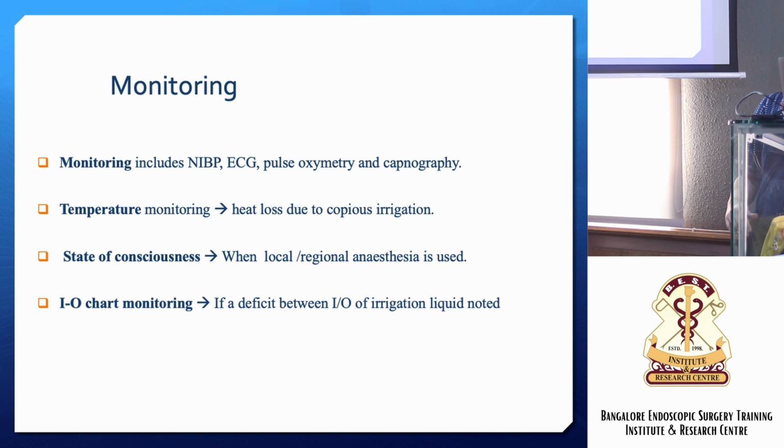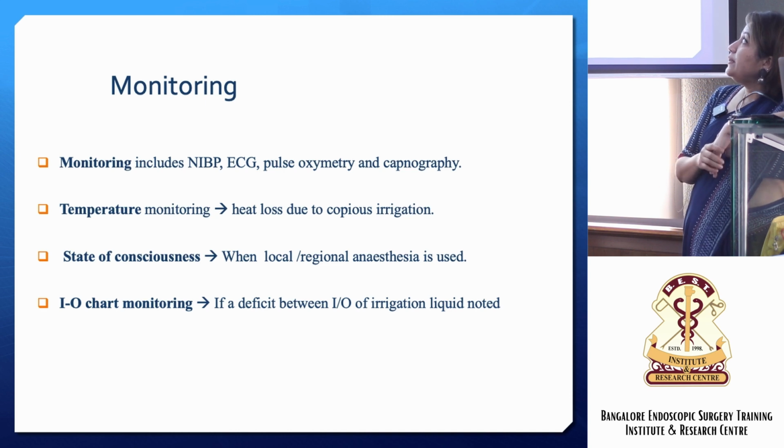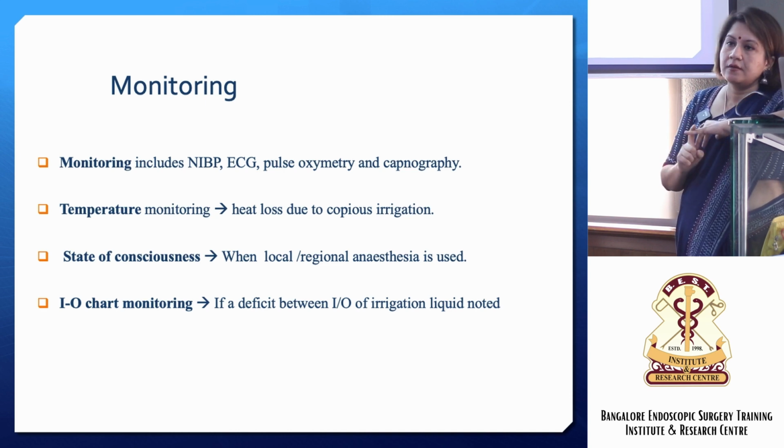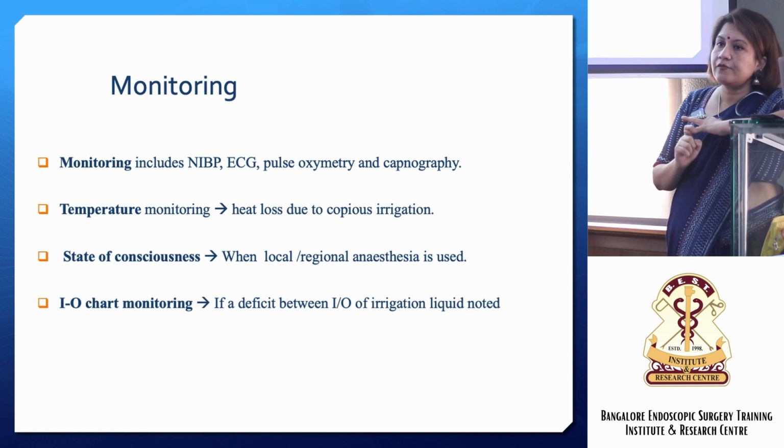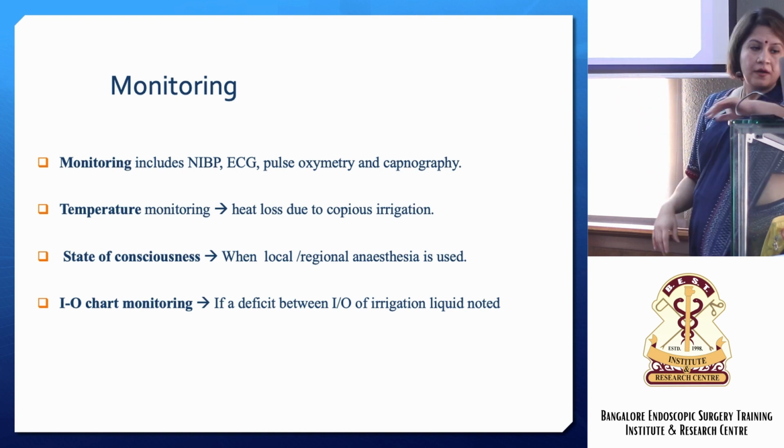Now what's important, especially if you are doing an operative hysteroscopy, is that you need to have a monitor which checks the oxygen saturation, because if there is a complication, we need ECG leads to be there. So you cannot perform especially operative hysteroscopy without having a monitor.